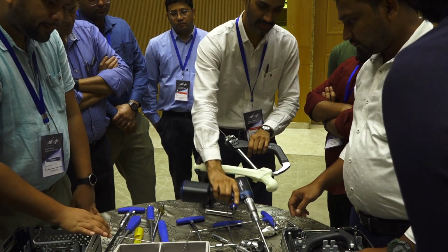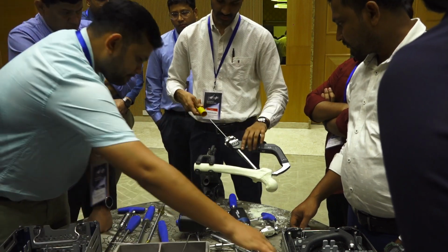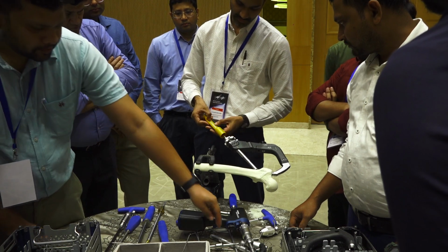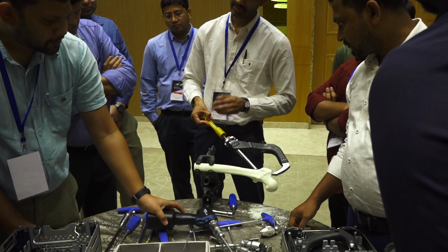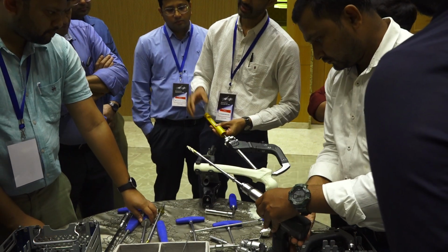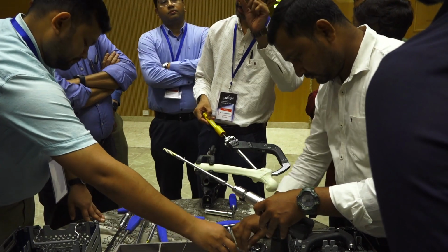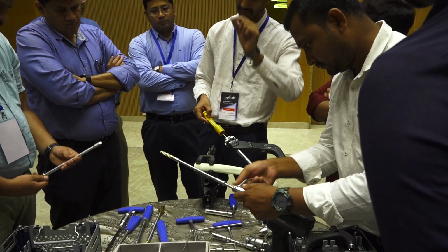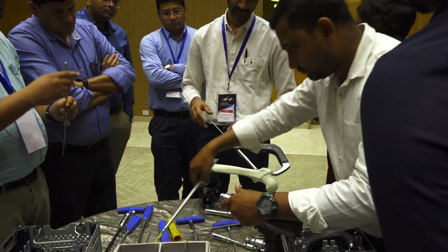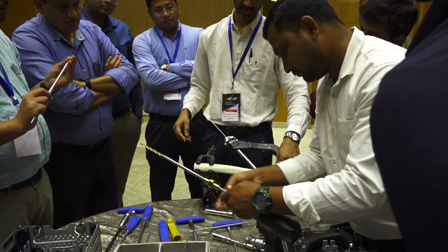After that, if it is an osteoporotic bone, you don't need anything. You take the measuring device before drilling this. You have to take this measuring device before perforating. You take the reading from here. You can take the lowermost. If it is 77, you can take a 75 helical blade. If your guide pin is 10 mm or 5 mm away from the joint line, don't take a longer screw. After that, if it is a hard bone, you have to take this reamer and ream throughout.